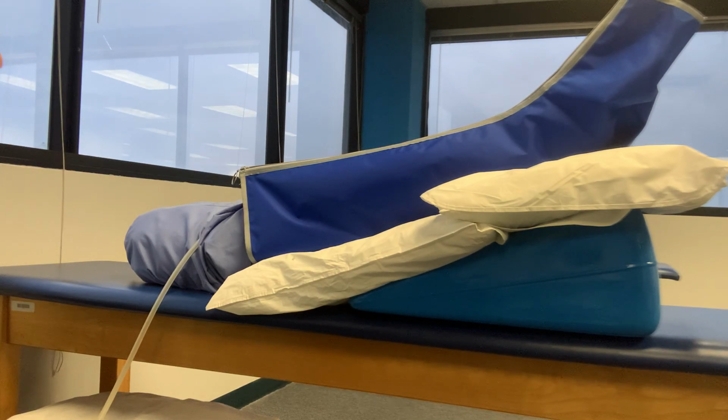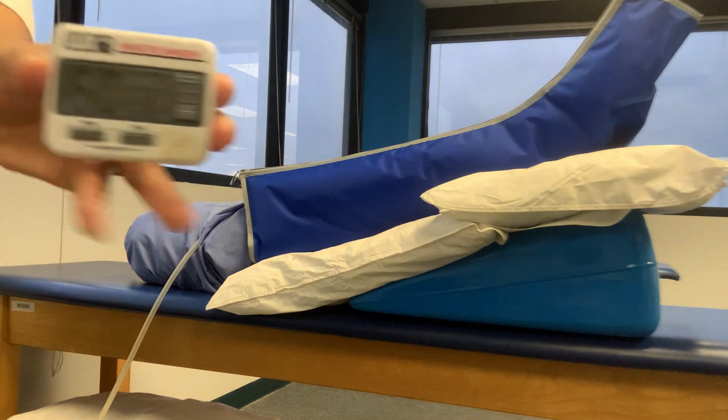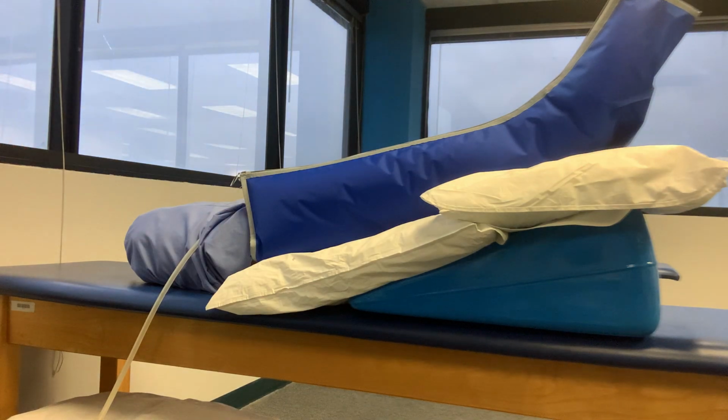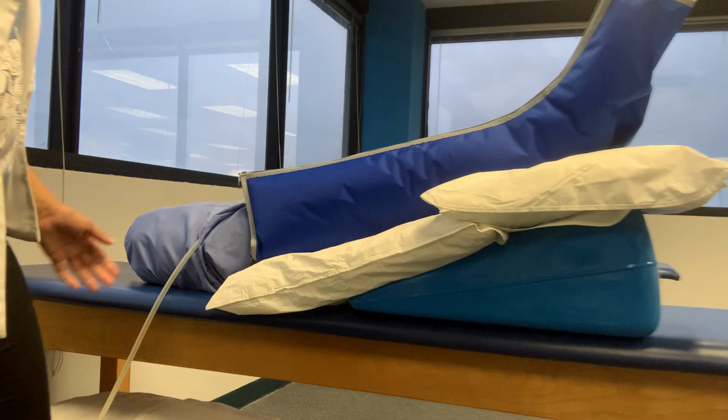So now you're actually setting the time for the rest of your treatment session. So since we don't have timers that go all the way up to 2 hours, you're just going to set your timer all the way for an hour. So you'll set it and you'll start it, and that way we'll know that you know that your treatment time is at least 60 minutes or more. So then we'll say to you, okay, your treatment time has ended. You'll stop your timer. You'll come on over, you'll turn off your machine, and you check, how are you doing? Are you doing okay?